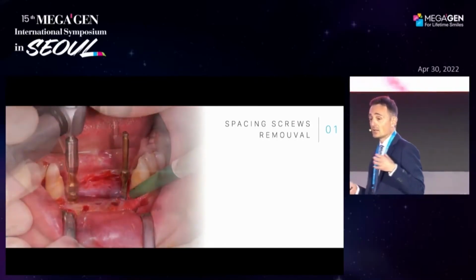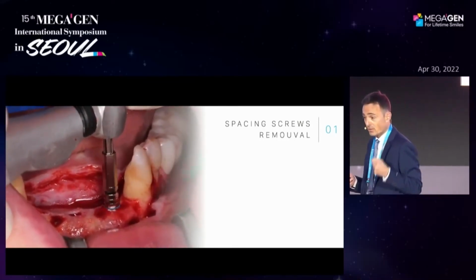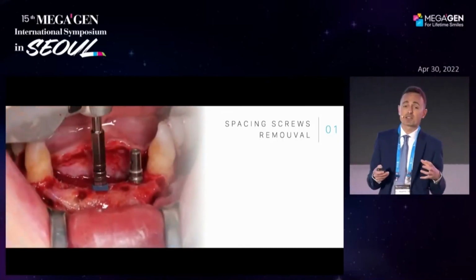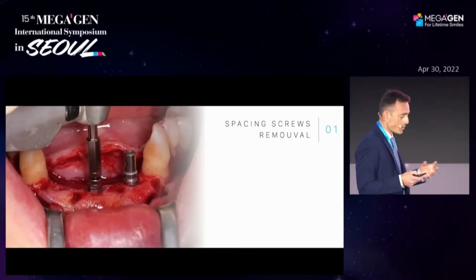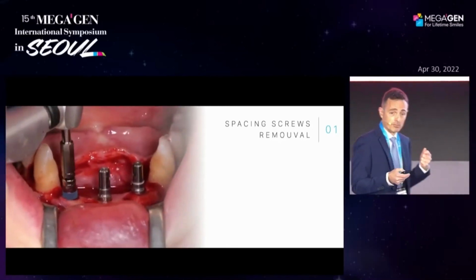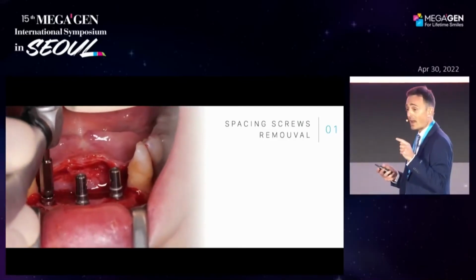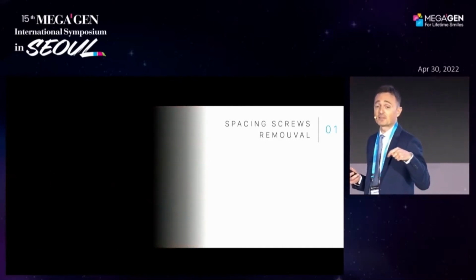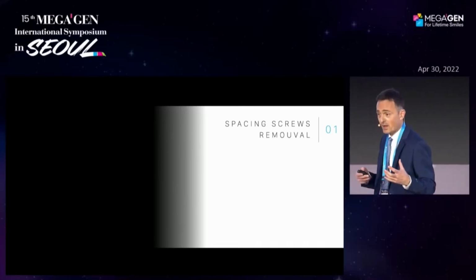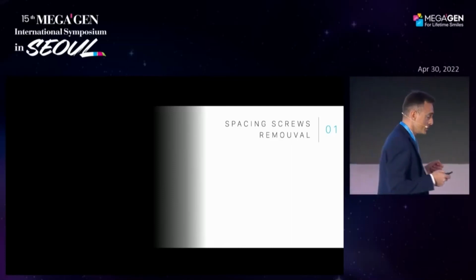I would like to suggest you to not under-prepare the bone, to follow the protocol, because we are managing a really not mature bone, and if you under-prepare the bone, you are running a great risk, because you are stressing the newly formed bone, and you can break the bone, and you also don't have to forget that we would like to go deep with the implant just to compensate the resorption that we will have in the following 2 or 3 years, and preparing the bone very well, you can get it.